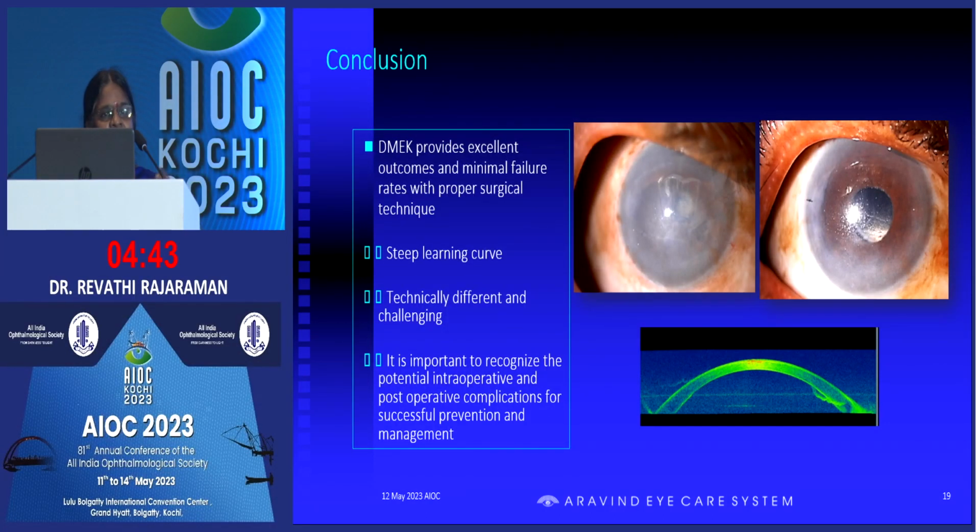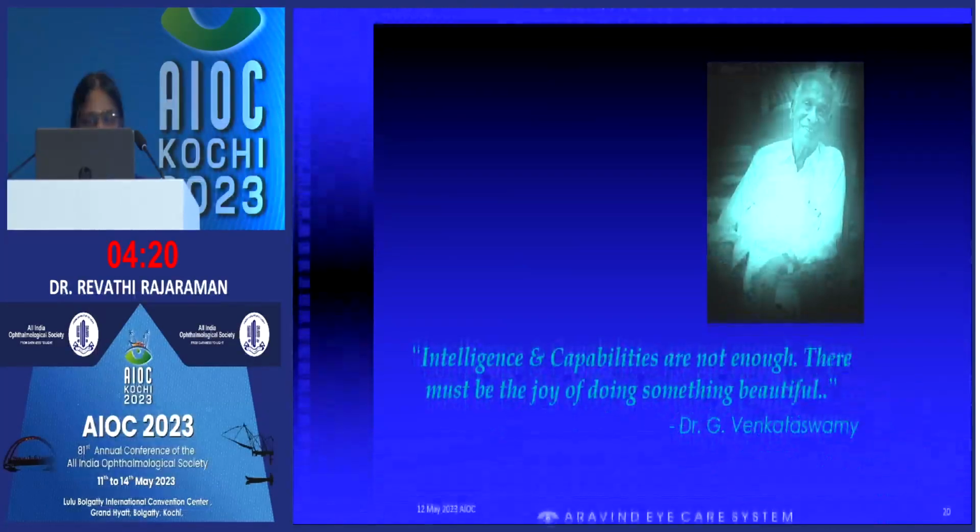So in conclusion, this is a very elegant surgery with elegant results, but the learning curve is steep. And we have to understand, if you are a DSEK surgeon, when you are switching over, this is a different surgery. So we have to unlearn something and we have to acquire newer skills. And we can't apply the same principles sometimes to manage the issues here. Thank you.